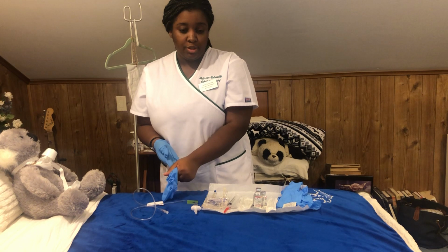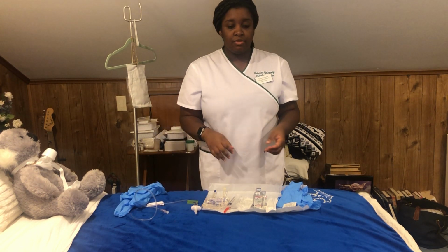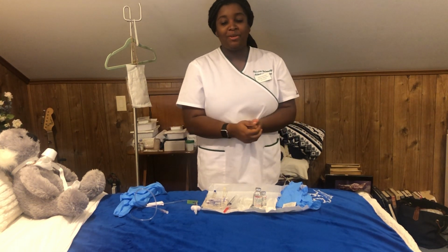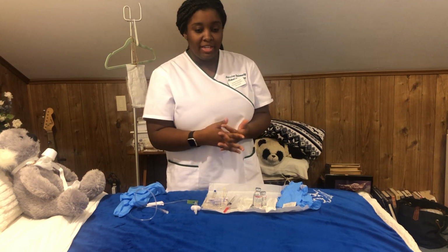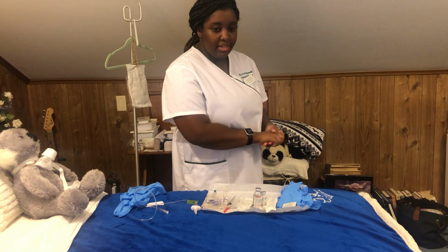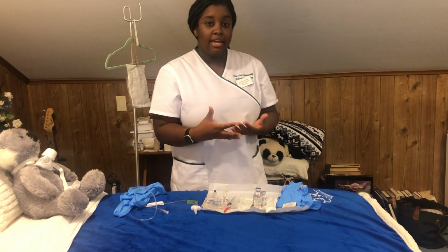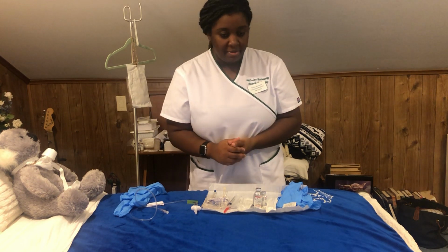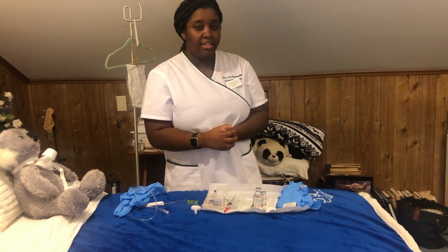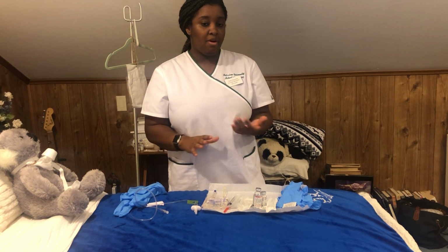Okay, so moving on, when I get to the patient's room, hello, I'm introducing myself again. Hello, my name is Tarika. I will be your nurse for today. And before we continue, let me do hand hygiene again once more. And I'm just stating my purpose here. Today, I will be administering IV piggyback solution of vancomycin, which is an antibiotic medication to treat the urinary tract infection according to your MAR.